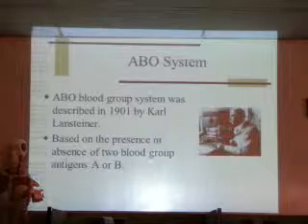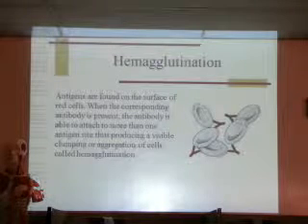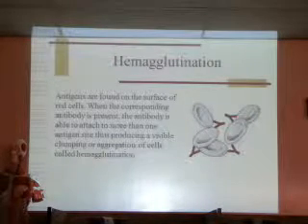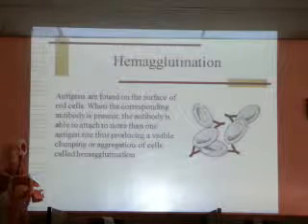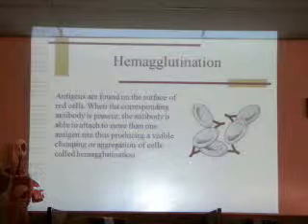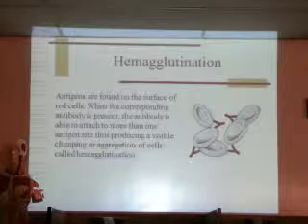So he won the Nobel Prize for that. And what he did was he studied hemagglutination. So hemagglutination, it tells you exactly what it is. Heme being blood, agglutination is clumping. So by the mixing experiments, he discovered some patients' red cells will agglutinate in the presence of a dissimilar person's plasma. And I'll show you some of those examples later. But all of blood banking, whatever we're doing in blood bank, is based on hemagglutination. We have lots of different tests, but they're all using the same principle of red cells reacting with an anti-sera or a person's plasma. And we look for those cells clumping.